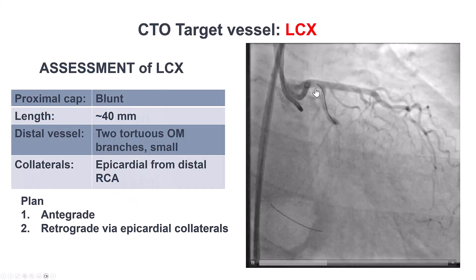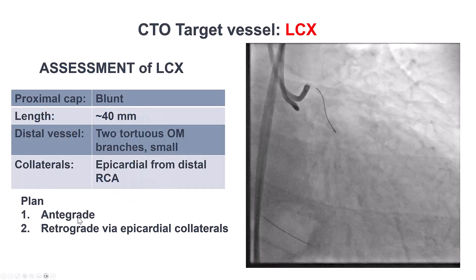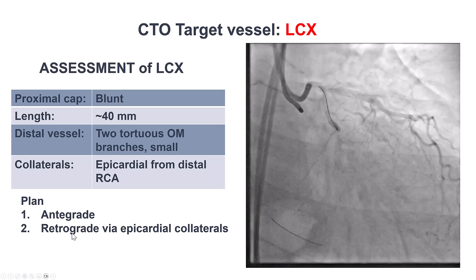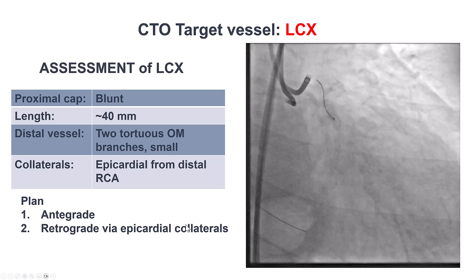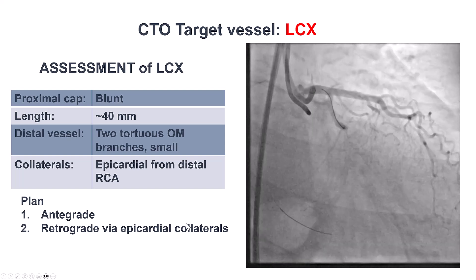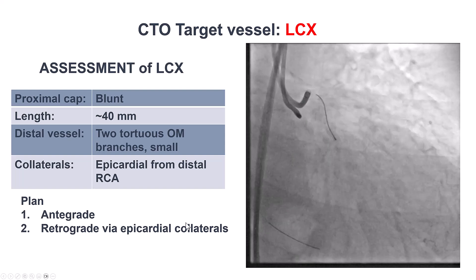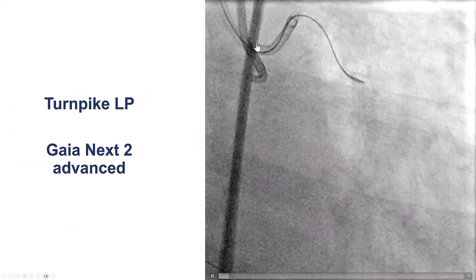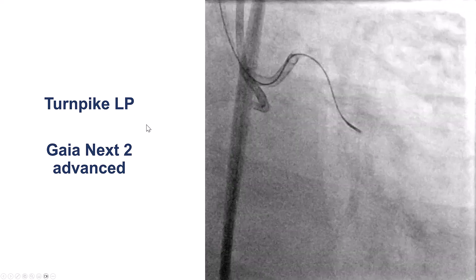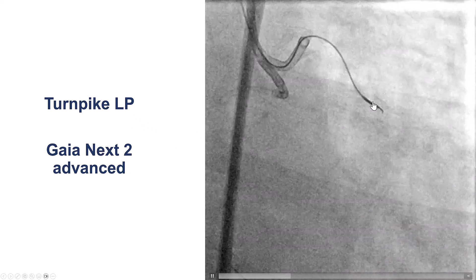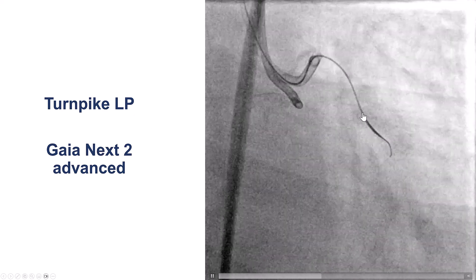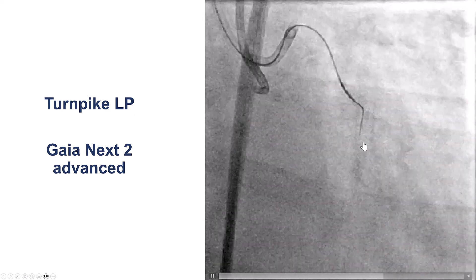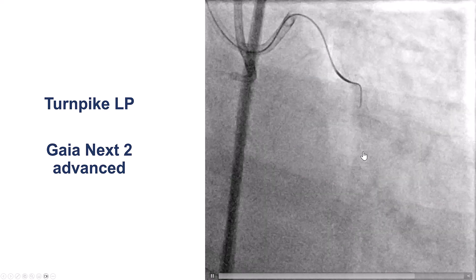Our plan was to try antegrade, and if that didn't work, consider retrograde through epicardial collaterals — though that was a very high bar because the collaterals were fairly poor and epicardial. We tried to cross using a Turnpike and a Gaia Next 2. We did make some progress, but the wire kept getting stuck within the previous stents, likely because of interaction with the struts of the previous stents.